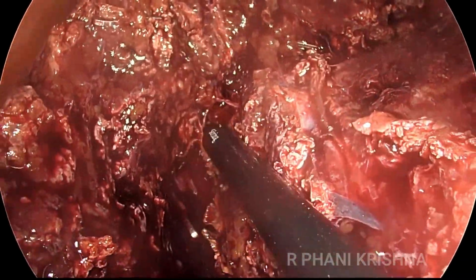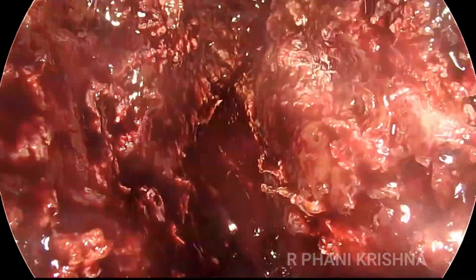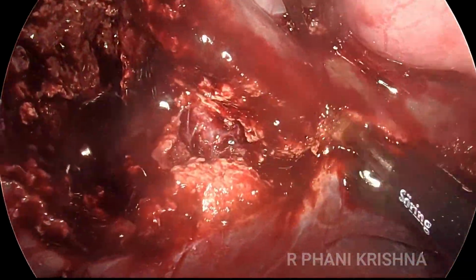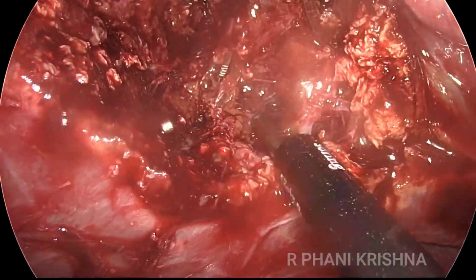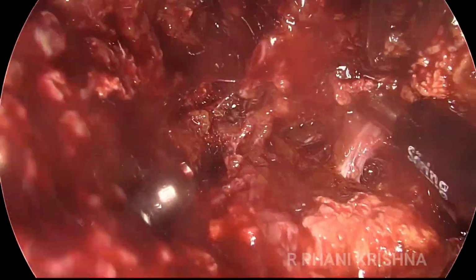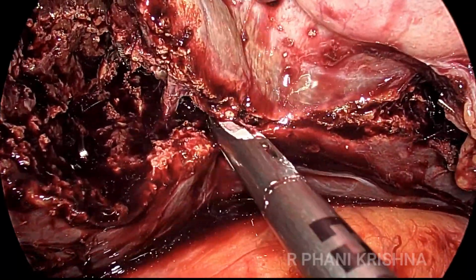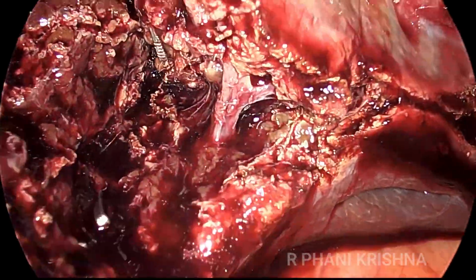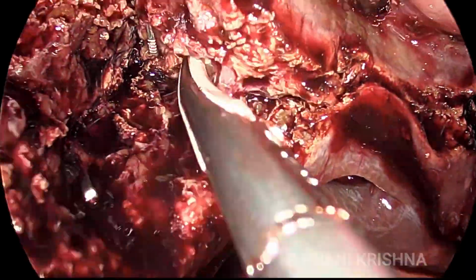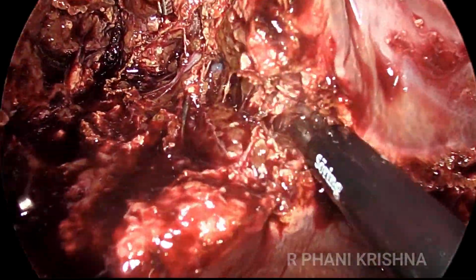We are using the intermittent Pringles here. So what we started inferiorly at the neck and the superior, both these planes are now being joined. Like you see, the wedge, or that's another segment 5 Glissonian pedicle. As I said, identify it, dissect it all around, make sure that only the pedicle is directly entering the specimen, and only then clip it, so that you don't disturb the inflow vascularity of the other parts of the liver we are leaving behind.